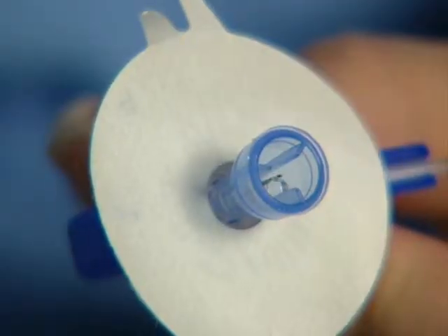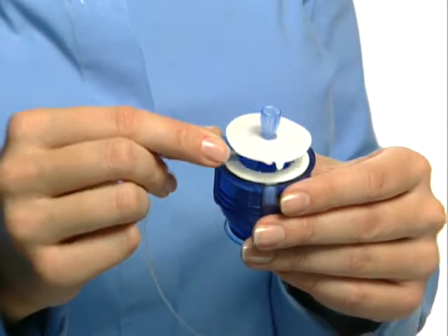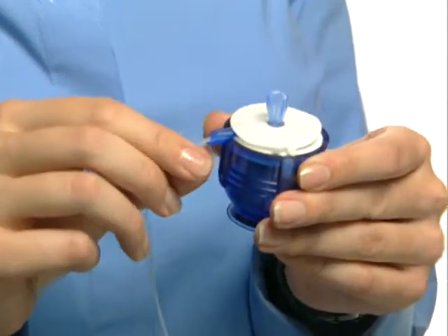After you've primed your Kwikset infusion set, place it into the Kwikserter device by aligning the tubing with the tubing slot.